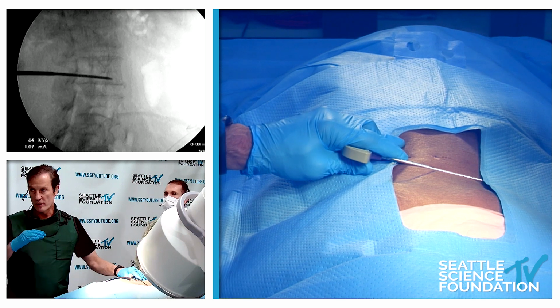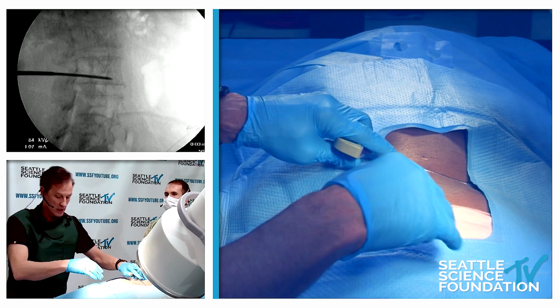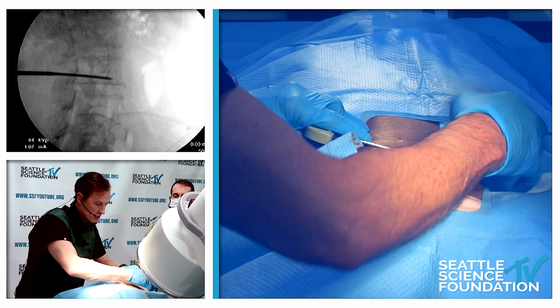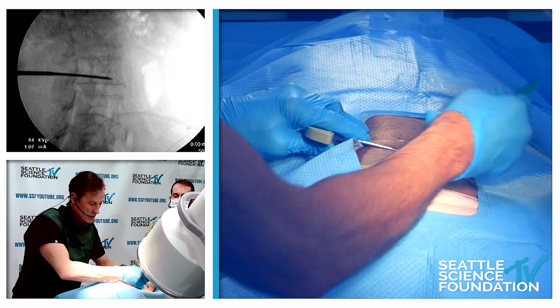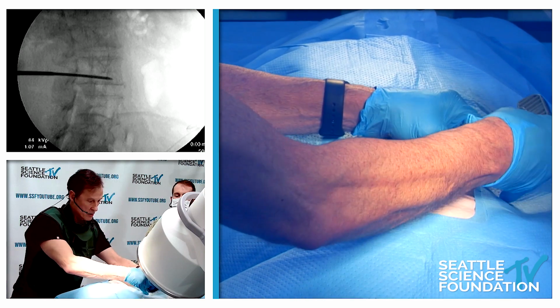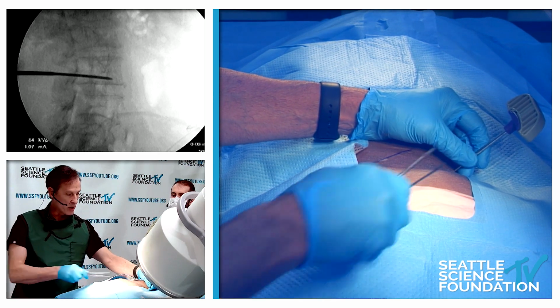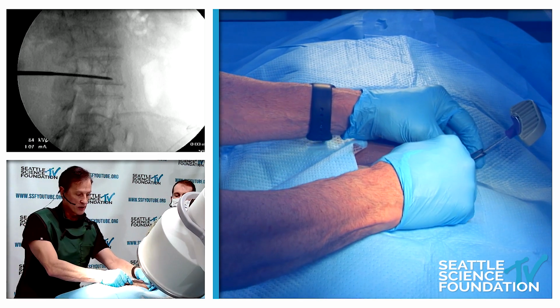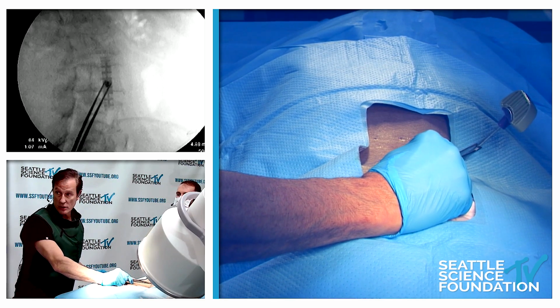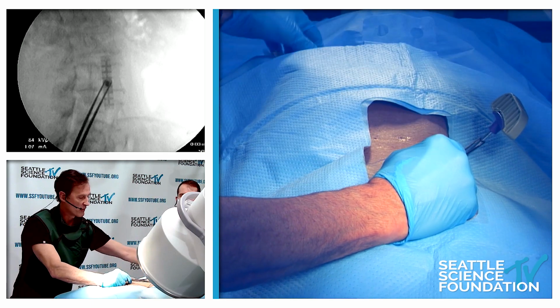If you go up to the 50-yard line, halfway up the vertebral body, that's the radicular artery. And that can and will bleed, so you don't want to hit that if you can avoid it. Sometimes it is hit, but the bleeding, although it can be aggressive, stops fairly quickly. It's not something really to be worried about. But these are all the safe zones, and if you align the safe zone and put the safe zone right there, oh, perfect, thank you.